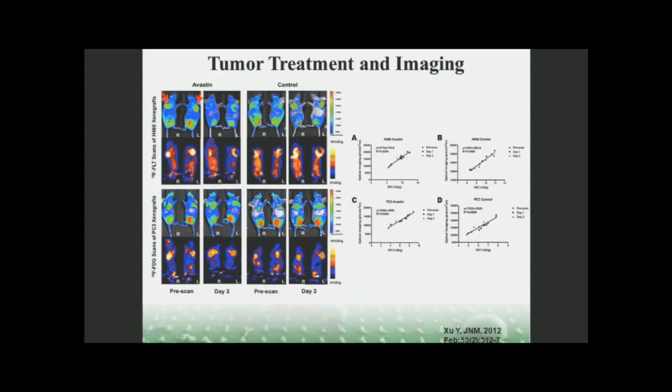So as you can see here, the uptake reduced, and the micro-PET also shows reduced uptake. For the other controls, the uptake has low change, for both Cerenkov Luminescence and micro-PET. And we can do the correlation assay to verify these two modalities have very high correlation. So especially for the subcutaneous tumor model, you can really use Cerenkov Luminescence imaging to evaluate the drug treatment.